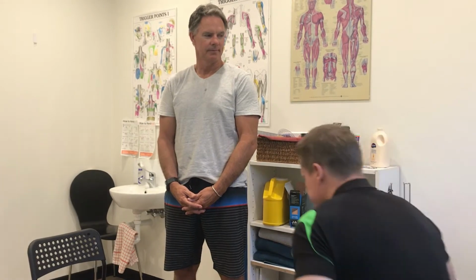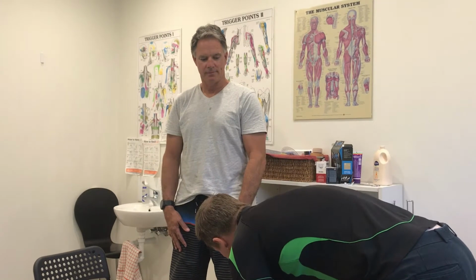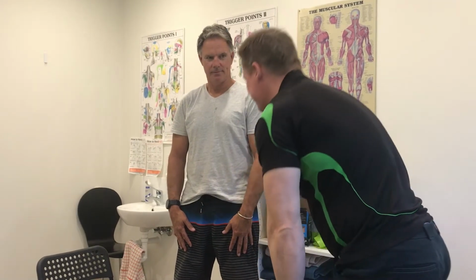The first one's flexion, so that's easy. So don't do it just yet, I'll just demonstrate. Hands on your thighs, just going to reach your fingers down to wherever you feel comfortable. When you get there, you're coming straight back. Don't need to stay down, and don't bounce your way down either, because you get this really jerky on the machine. So nice, smooth, and go.